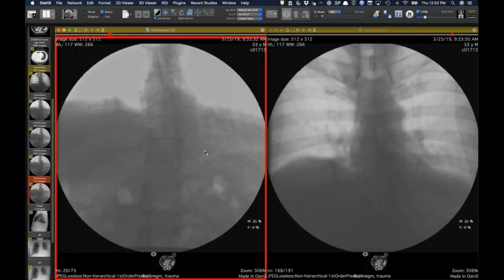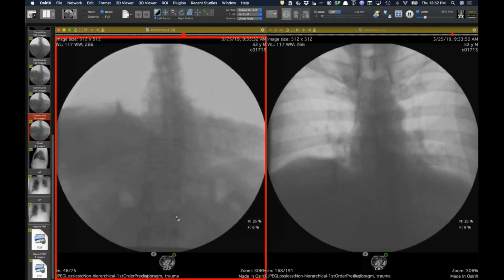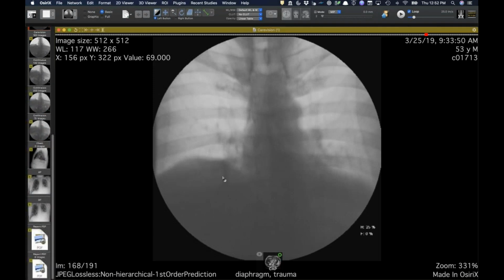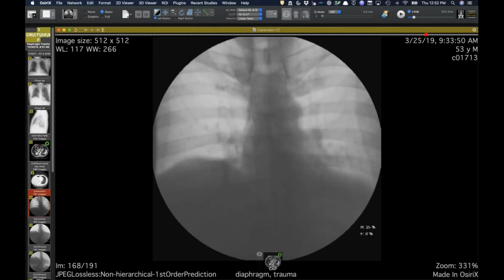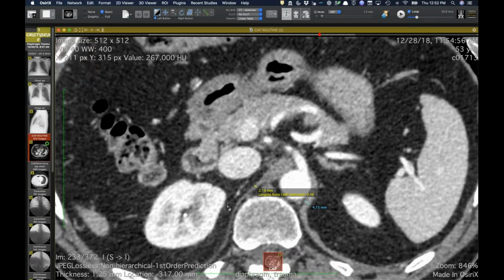But paradox just indicates relative weakness. It doesn't tell you it's paralysis. Right. But I think that's why I like your CT measurements, because I think that does help and lends more information on studies that we routinely do even before you get to a sniff test.